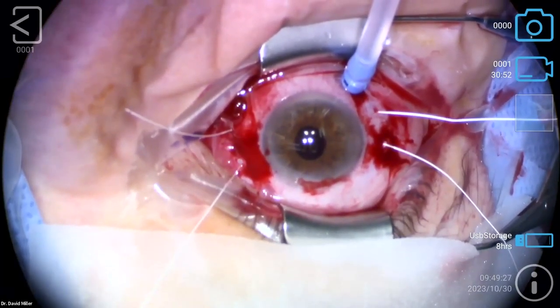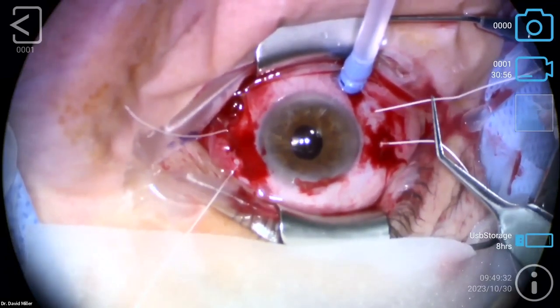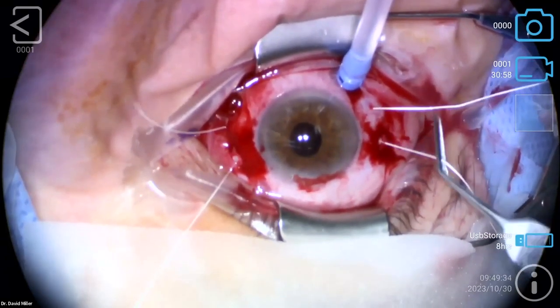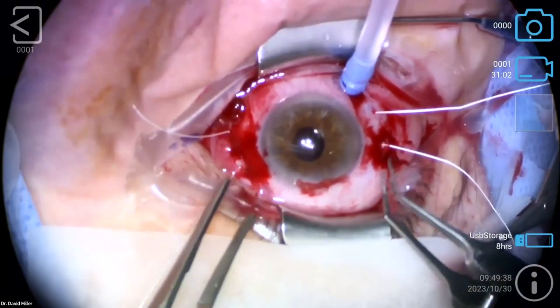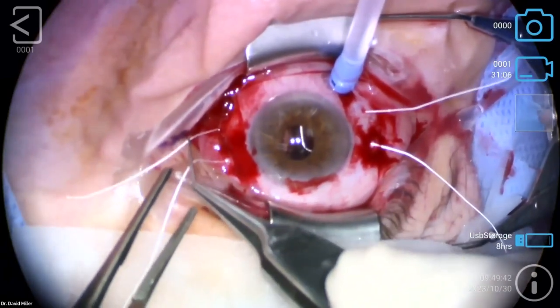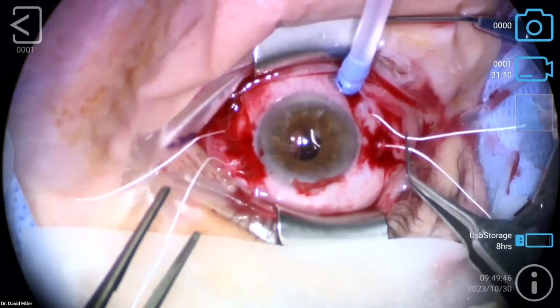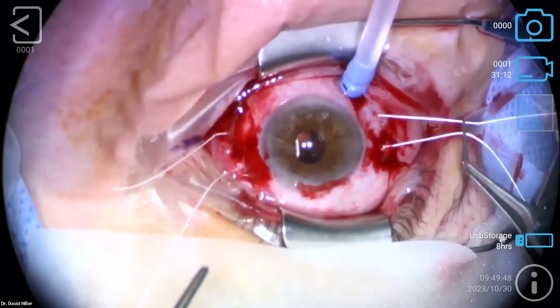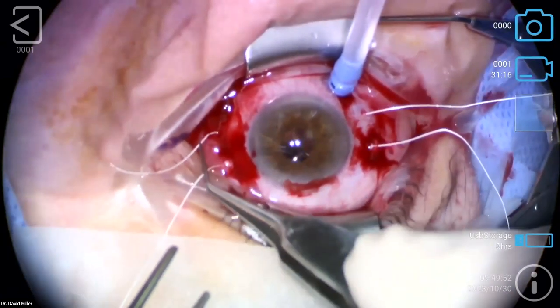What we're looking at now, again, we want to make sure everything's lined up. You could still replace these sutures in different locations or clock hours if you wanted, but you can see how well that lens implant centers up. These look pretty symmetrical, so we're in pretty good shape. You can see the suture right there going through the temporal haptics. We pull it over nasally, or temporally. You can see the nasal ones are like that too. No twists, no wrapping around the haptics.